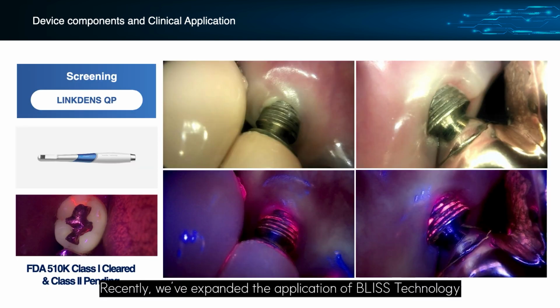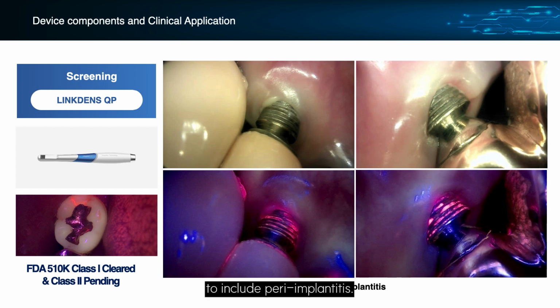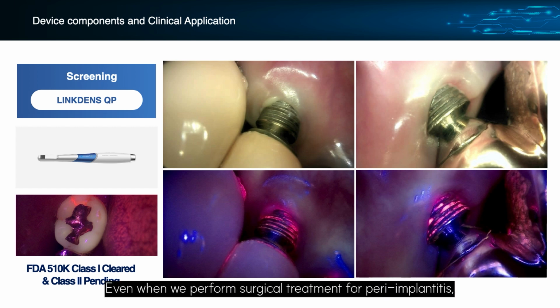Recently, we've expanded the application of Bliss technology to include peri-implantitis. Even when we perform surgical treatment for peri-implantitis, it's difficult to determine whether biofilm remains on the implant threads. Although lasers are often used to remove it, if we could actually visualize where the biofilm remains, the removal process would be much more effective, and the surgical outcome would be significantly improved.